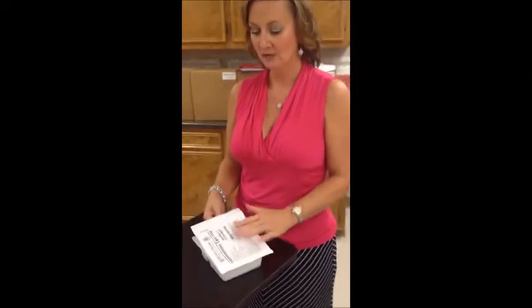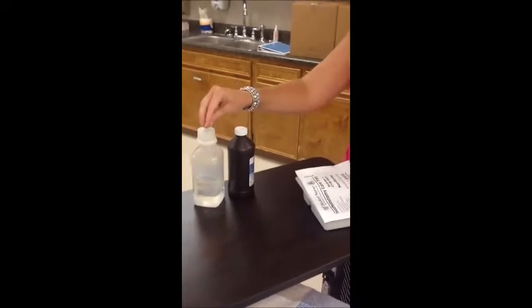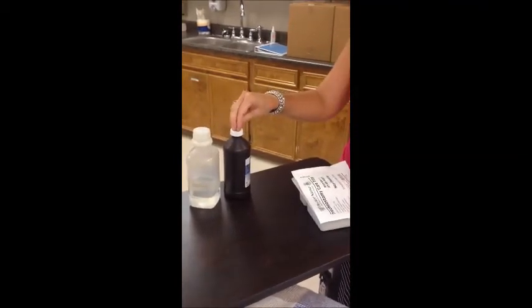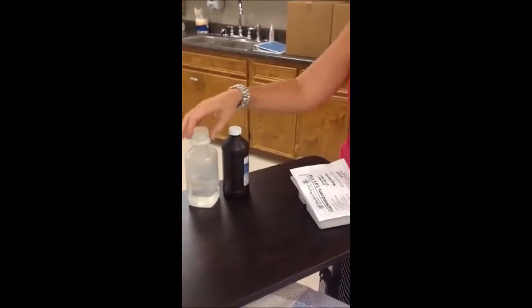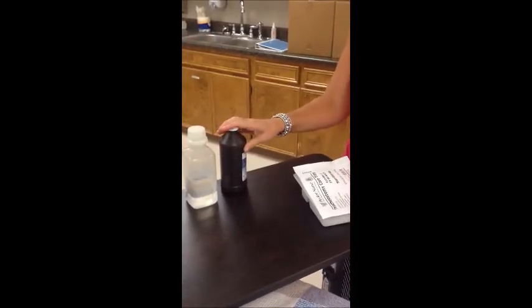Okay, this part is the actual care. This is a sterile procedure. You'll need your tracheostomy care kit. Depending on your hospital, you may use normal saline and peroxide or just the normal saline. This will always be a component though. Some hospitals allow you to use the peroxide.